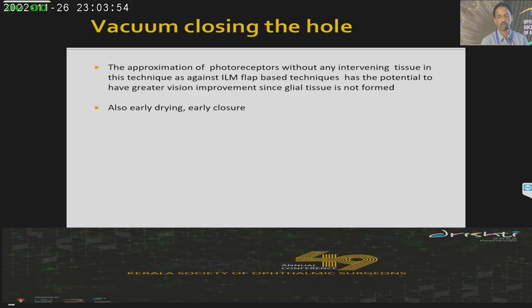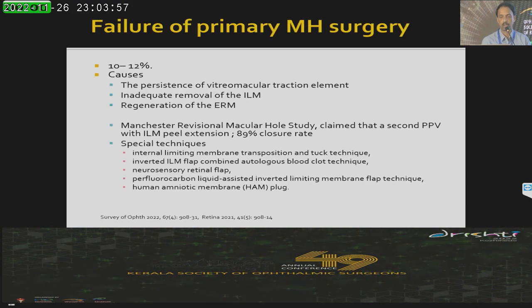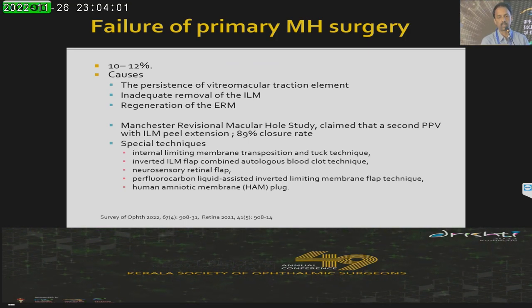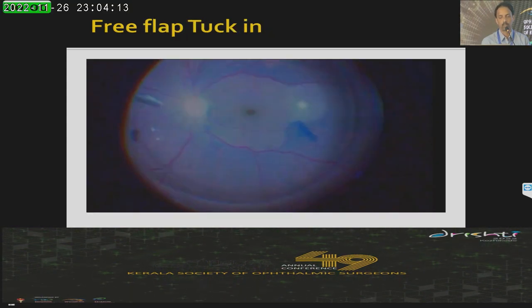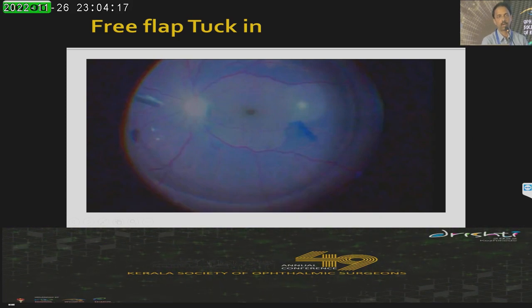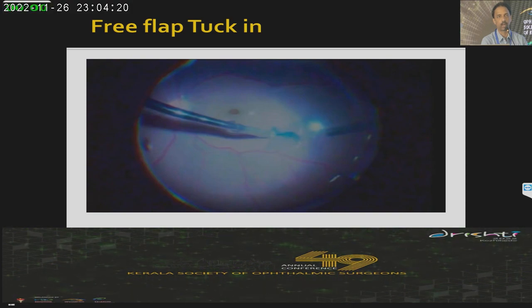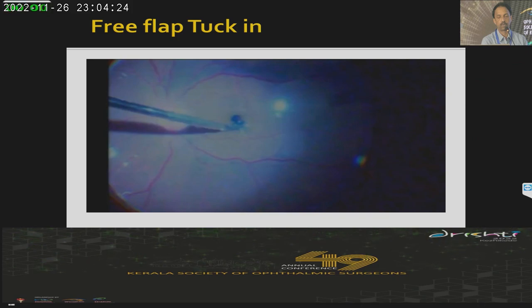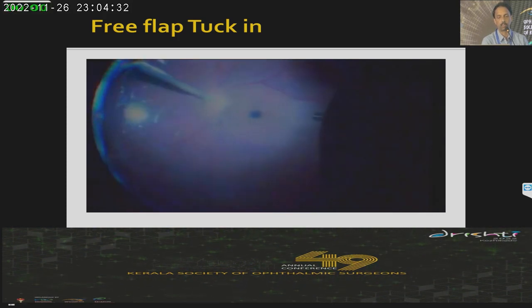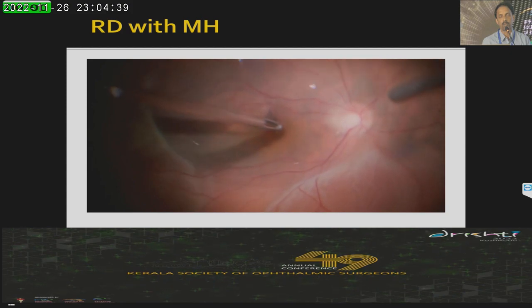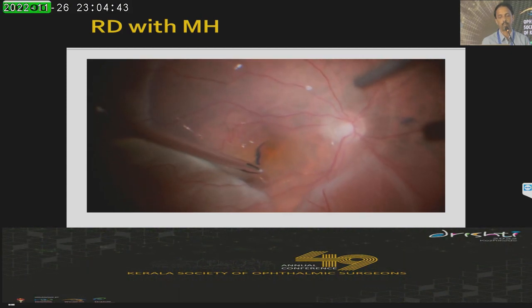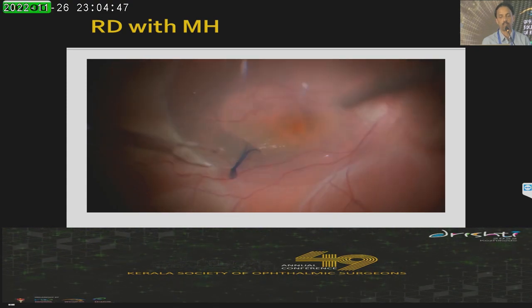We had a paper at this conference where we showed it was as efficient as ILM tucking. The failure rate of macular holes is around 10 to 12%, most often due to persistence of vitreo-macular traction or inadequate removal or regeneration of the ERM. Such patients definitely need an additional procedure like tuck-in. For failed macular holes, I like to use PFCL — free flaps are very mobile, so putting in a PFCL bubble and taking these free flaps under the PFCL bubble and closing is a very useful technique. In retinal detachment, peeling under PFCL helps keep the posterior pole attached.